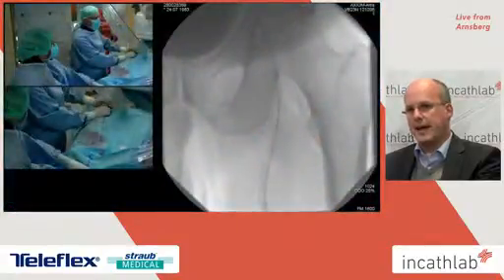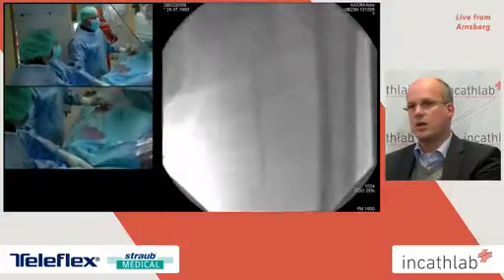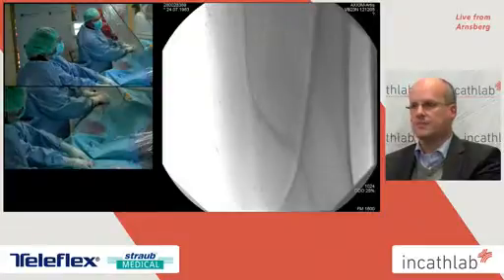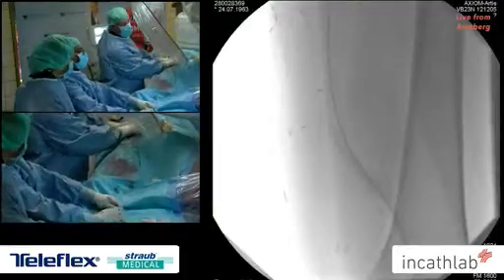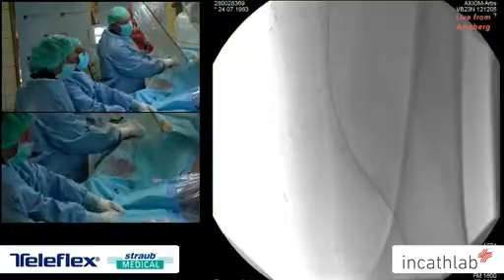So always take care of enough blood flow so that the catheter can work with that flow to really detach thrombus. This is very important. That's why the catheter works more efficiently if you work in an antegrade manner compared to a retrograde approach.